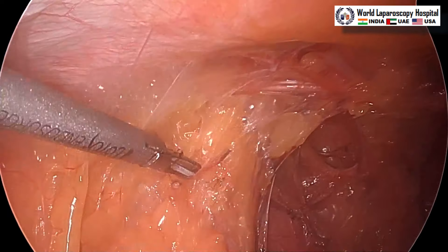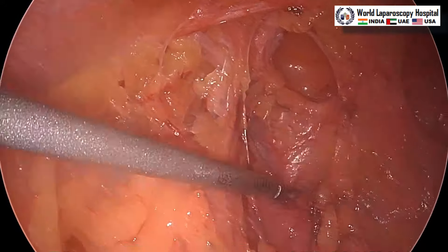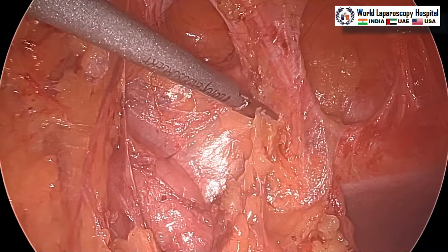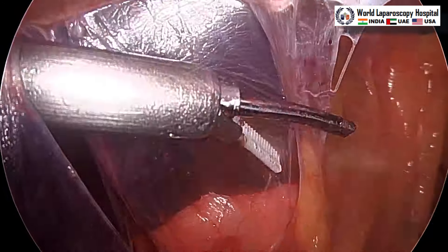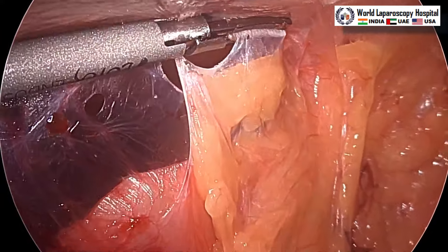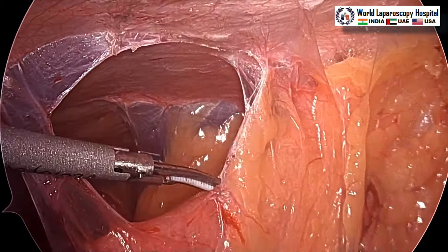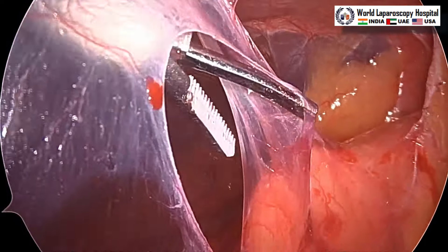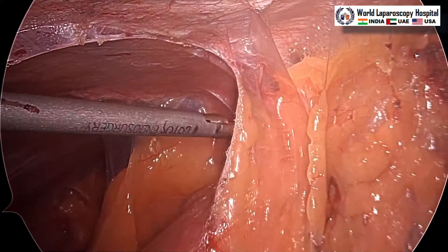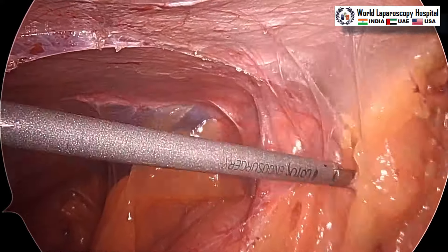But we have to go a long way with the adhesiolysis, so we will see how to remove those adhesions carefully. You have to be very careful because in the jungles of this omentum there may be hidden bowel loops. It has to be a combination of blunt as well as sharp dissection with the harmonic. This is again all omental adhesions, slowly separating. We have only one instrument — no grasper, only the harmonic and a telescope. Working with one instrument, if you are very careful the harmonic and gravity will help move the bowel away. Behind the omentum is the bowel; a small bowel is adhered and can be bluntly separated from the anterior abdominal wall.